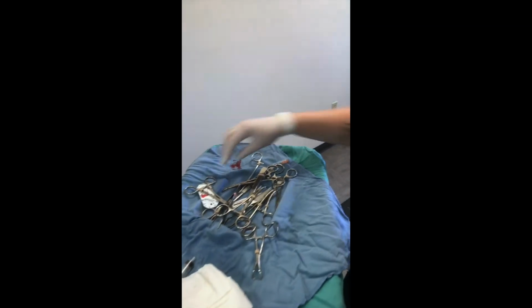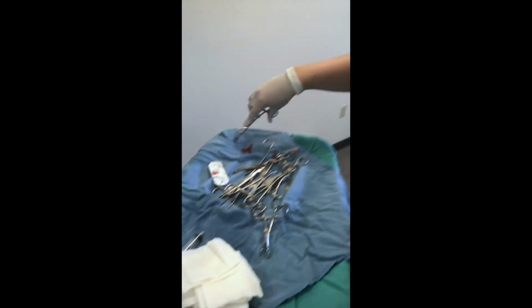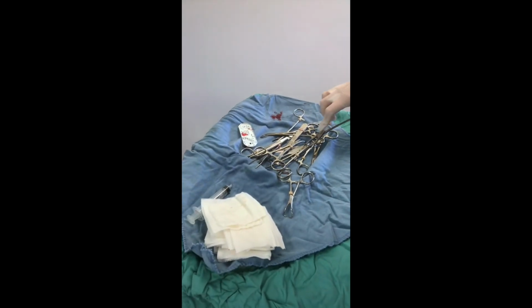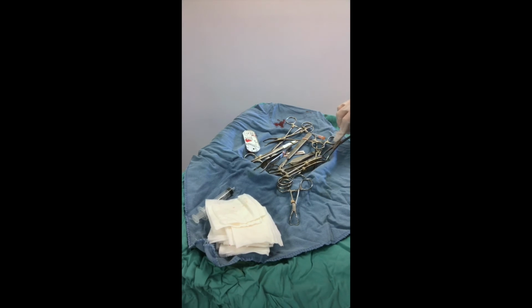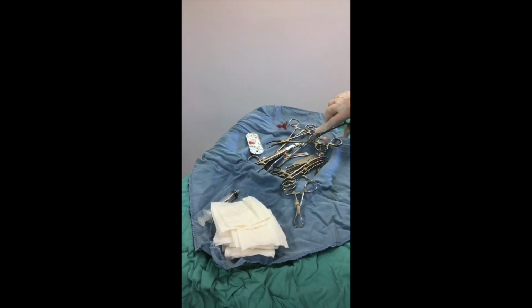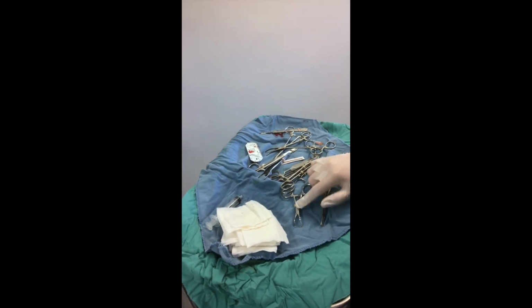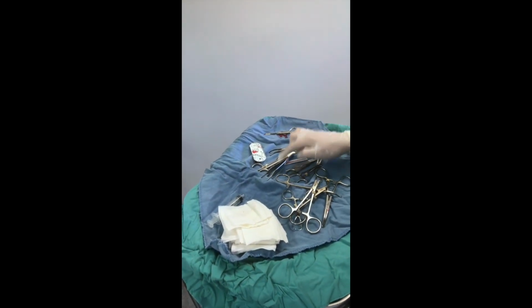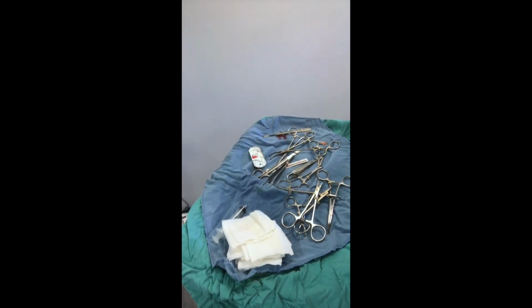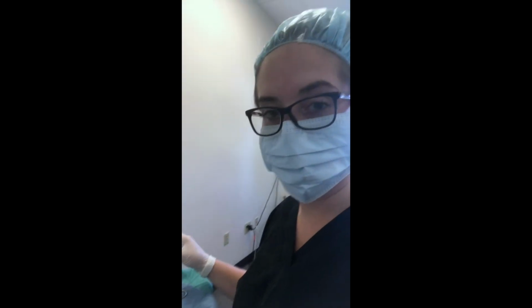There's 15 gauze. We're going to carefully look for our sharps. There's a needle here. One, 2, 3, 4, 5, 6, 7, 8, 10, 11, and 12 instruments. And then I will put my sharps in the sharps container and we'll clean up surgery.